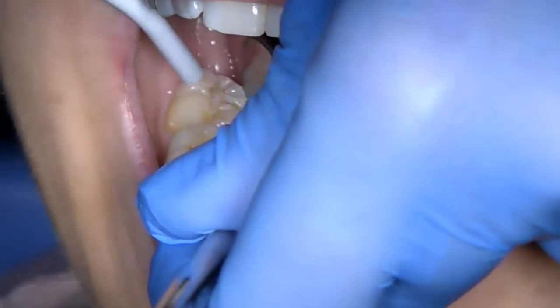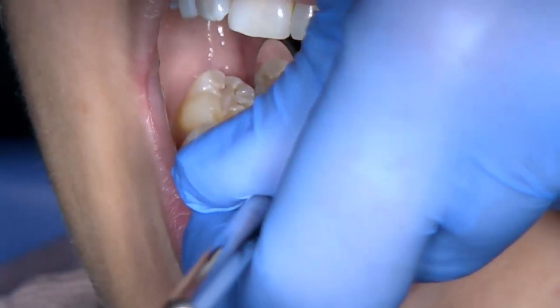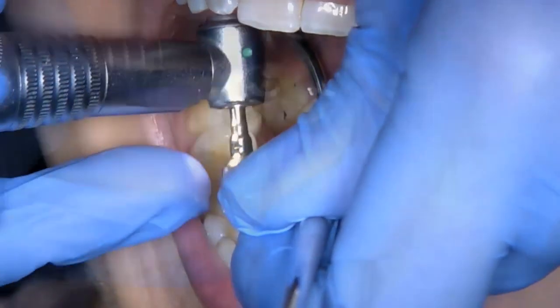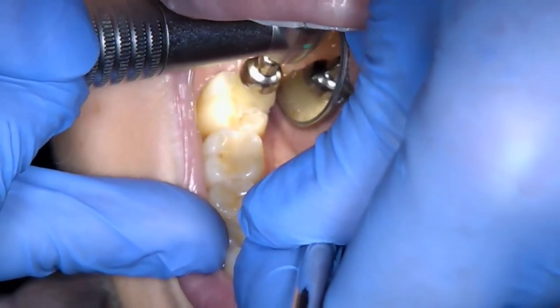Today I am going to demonstrate the correct clinical procedure for the placement of a resin fissure sealant. The clinical examination revealed that tooth 4-7 has partially lost its fissure sealant and the caries risk assessment indicates that this patient would benefit from having the fissure sealant replaced.